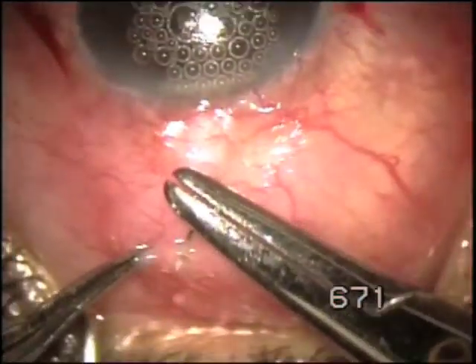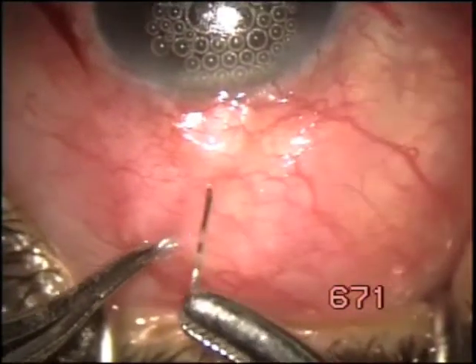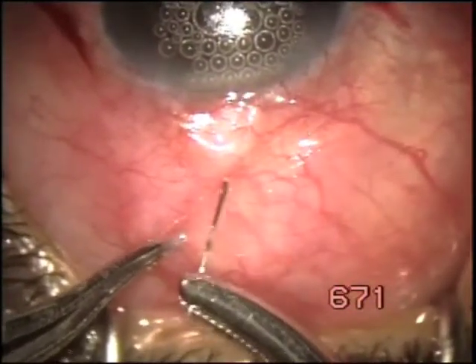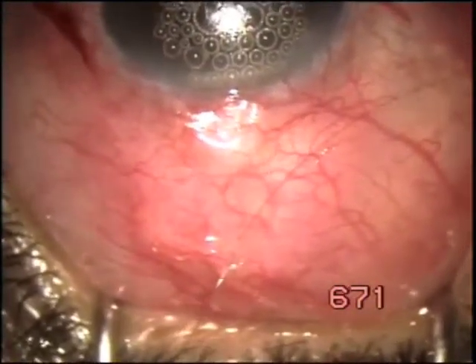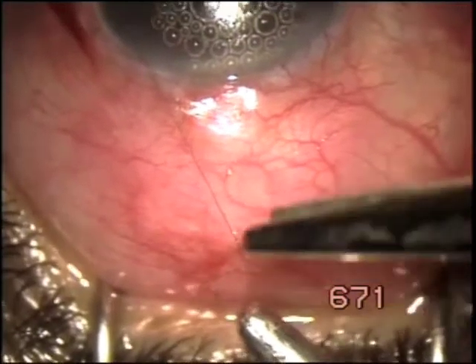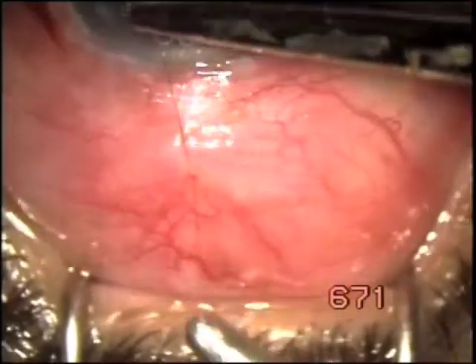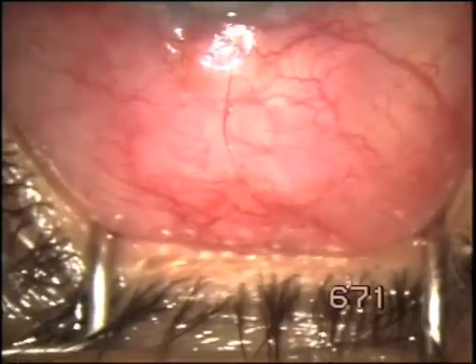It fills the anterior chamber with air too. Then in the end, one suture to the conjunctival opening through which all this surgery was done.